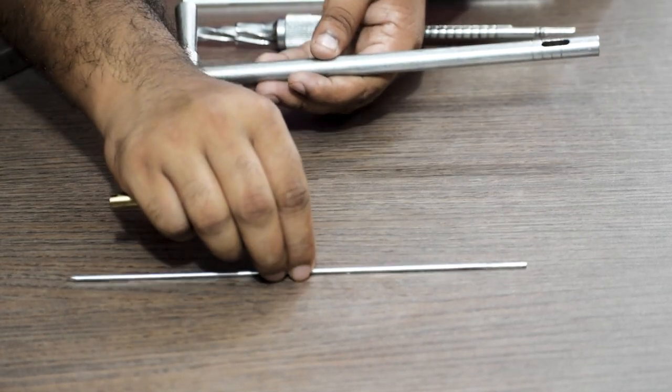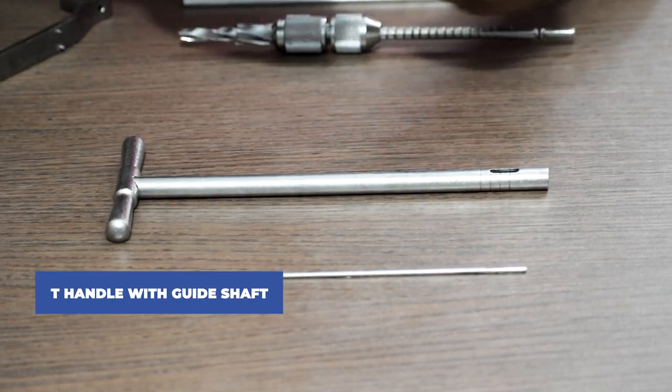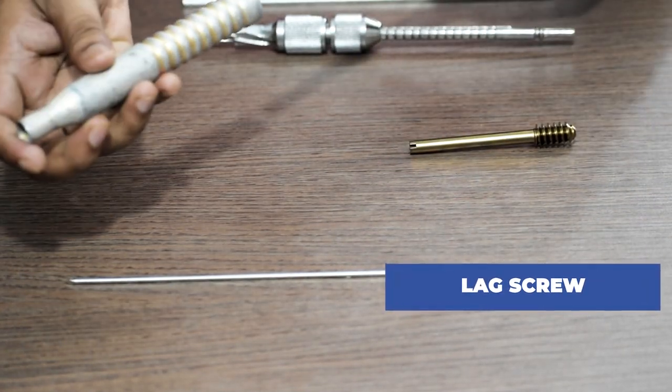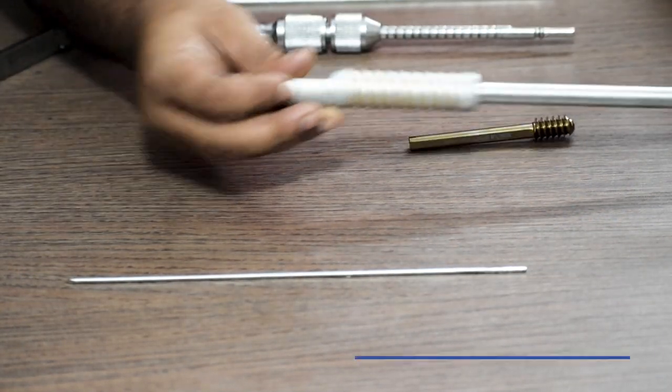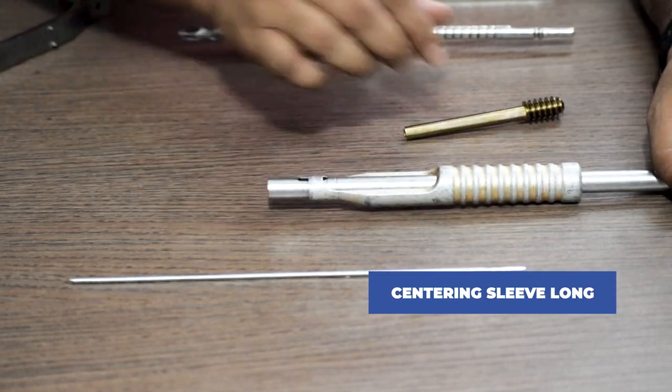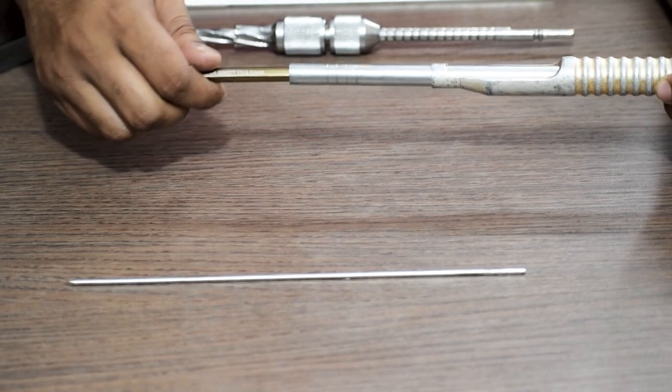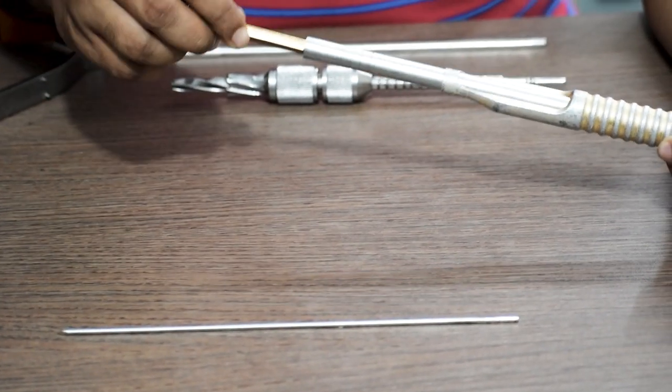Once the tapping is done, we will take a T-handle with guide shaft and a lag screw. First we attach the long centering sleeve in the T-handle, and then connect the screw with the T-handle.